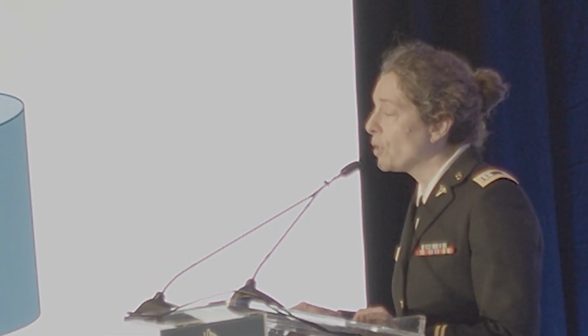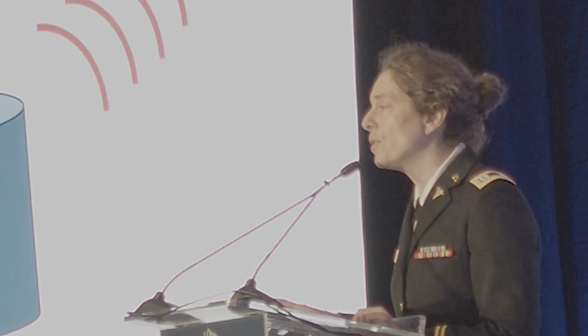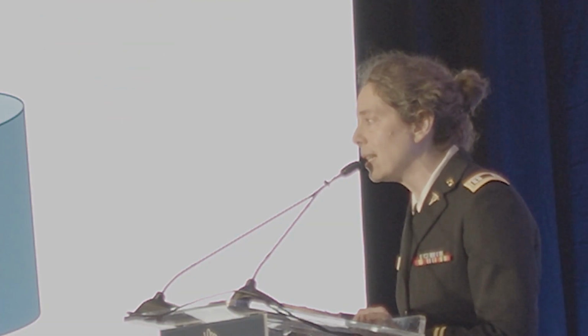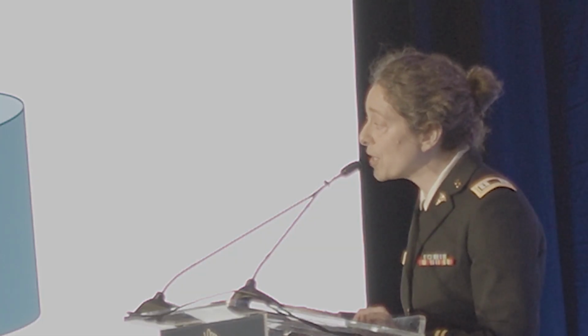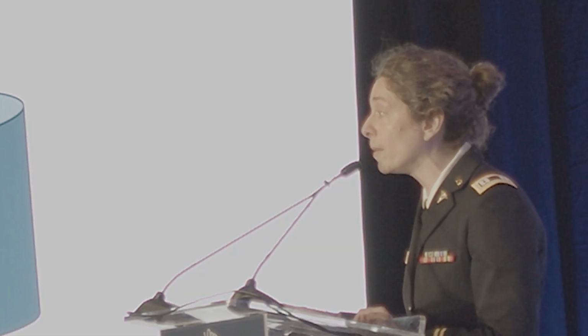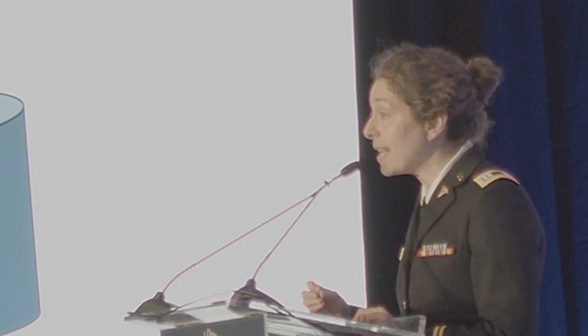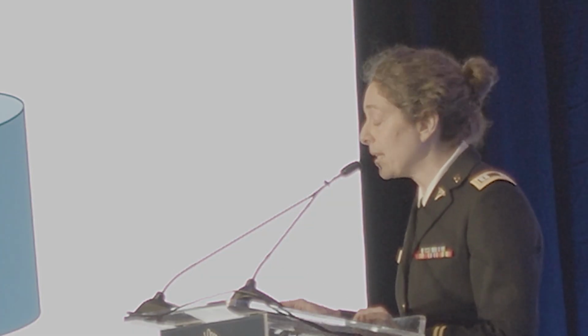Well, all ultrasounds convert electrical energy into sound energy through a process called the piezoelectric effect that's accomplished by the ceramic crystals in the ultrasound probe. It was not known if this process, which uses electromagnetic energy, would generate a substantial electromagnetic signature.